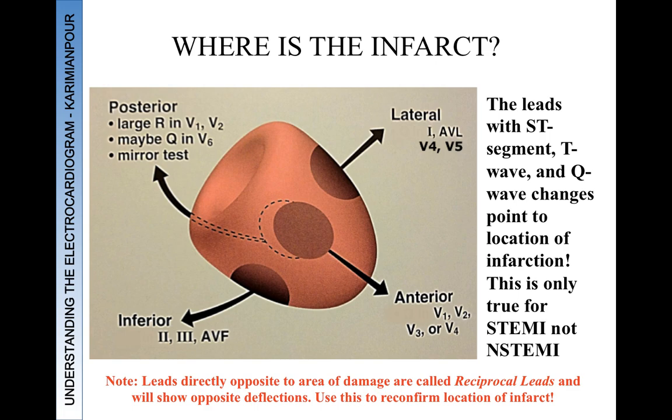A posterior MI and changes seen in V1 is a little bit different. That's coming up, and I'll show you a couple of ECGs of a posterior MI. That's one that sometimes is easily missed.